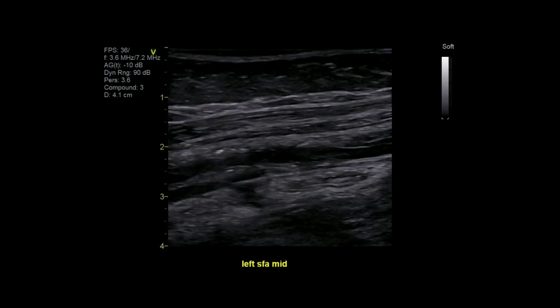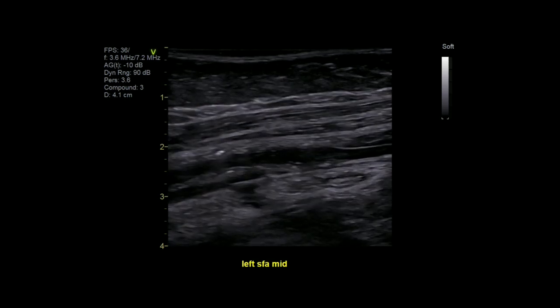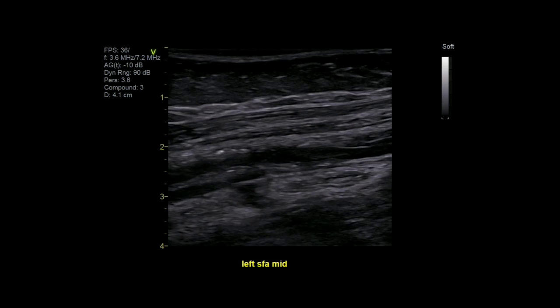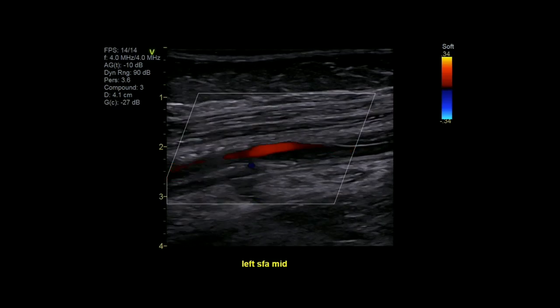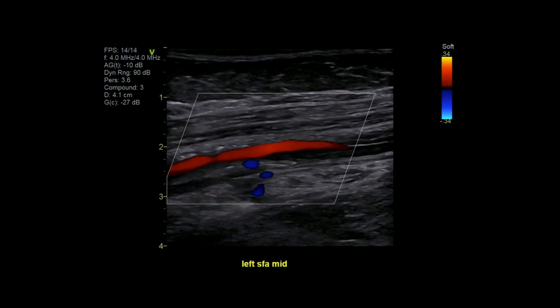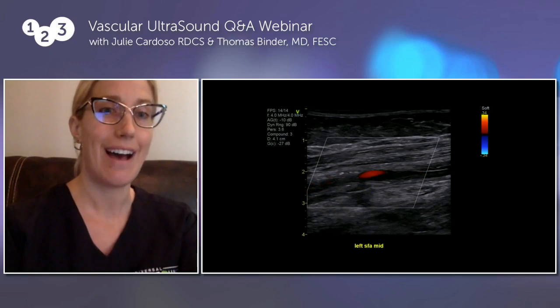And we can see further down the same vessel, we have another, different plaque characteristic with B mode. Now, again, it's hard to tell what the stenosis diameter is because we're looking at a two-dimensional view, right? So we utilize our color flow Doppler, as you can see right here in the next clip. And you can see, again, there's aliasing. And we also see a collateralization coming in from the bottom of our screen, which is really neat.